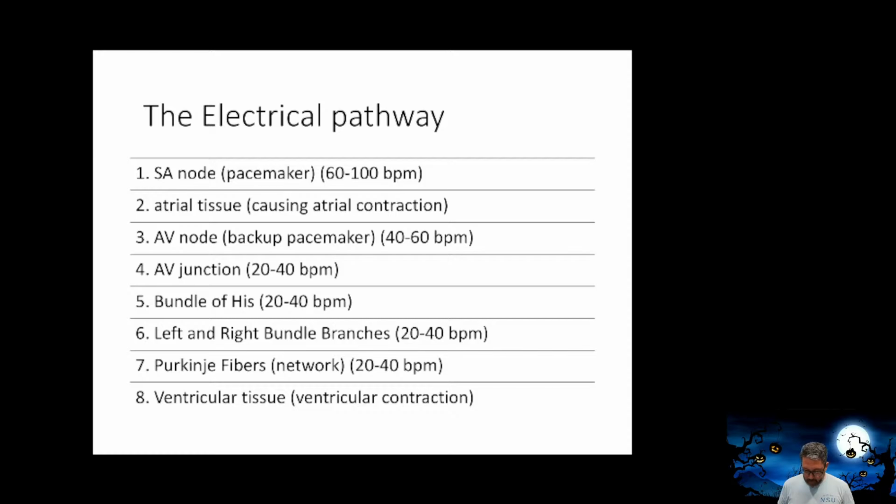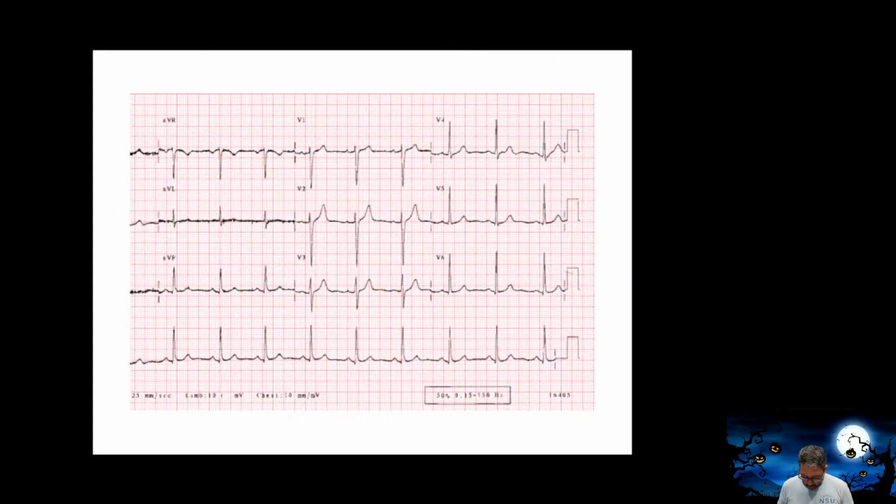Okay, let's go through some stuff here. A couple things about paper. Make sure you know time going that way, millivolts going up. What's the printer speed of the paper? Tells you right there, 25 millimeters per second. Make sure you know those things.